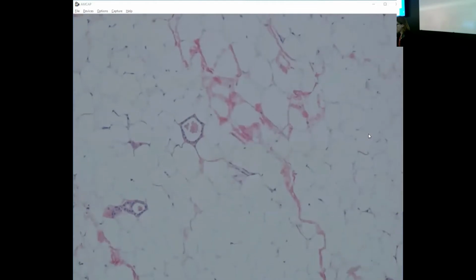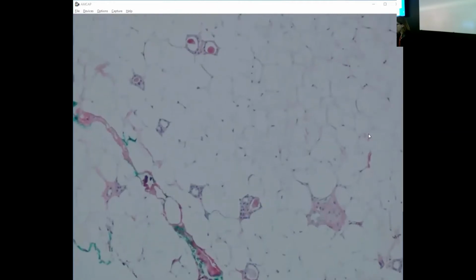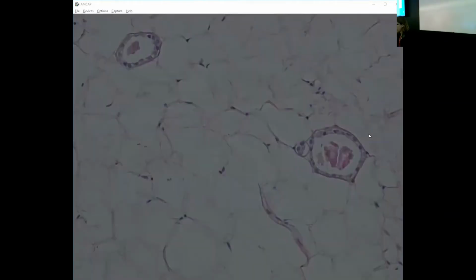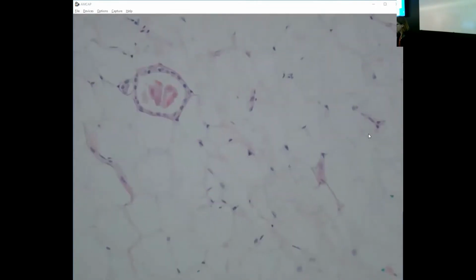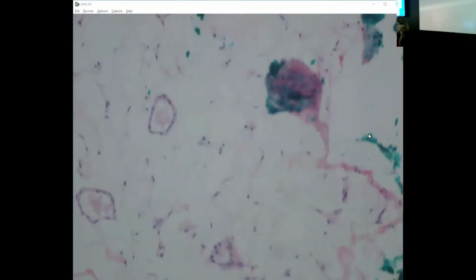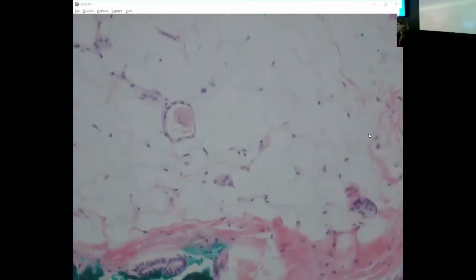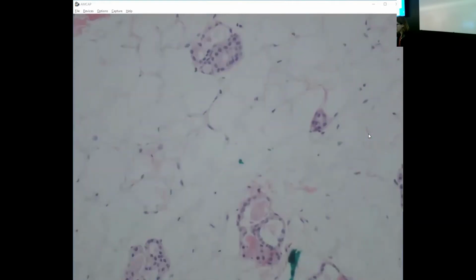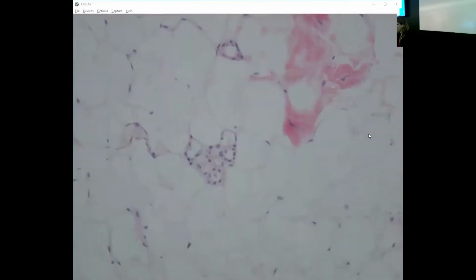But yes, we have these small glands scattered in a haphazard pattern in the adipose tissue, with luminal secretions, as was mentioned. They often have bright eosinophilic secretions. And usually the epithelial cells look very bland, round, and monomorphic. And then there's no myoepithelial cell layer, which is totally bizarre for something that we're calling adenosis.